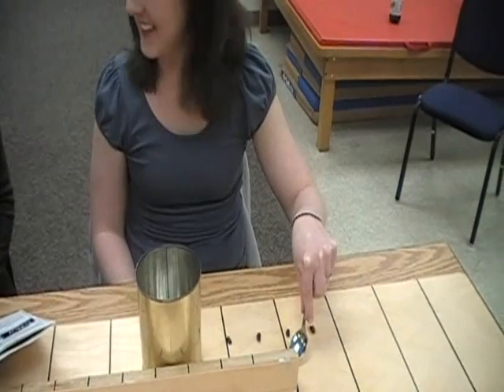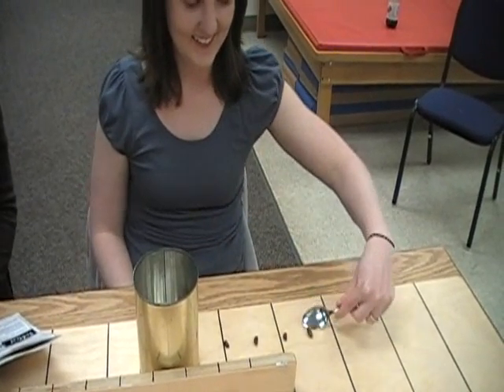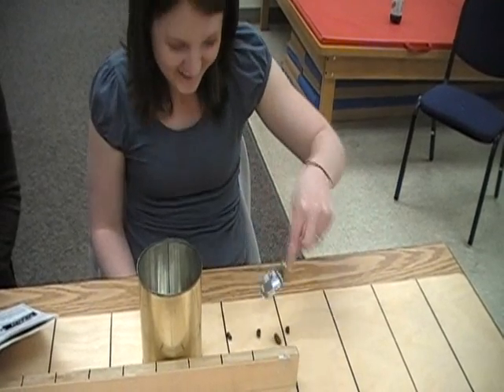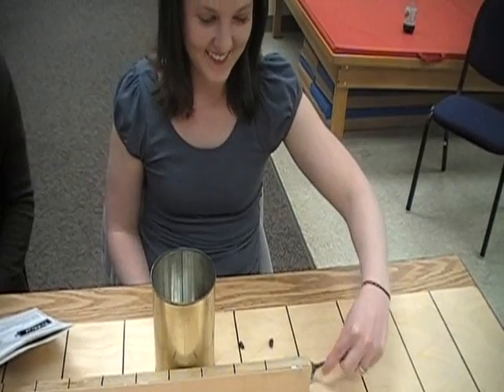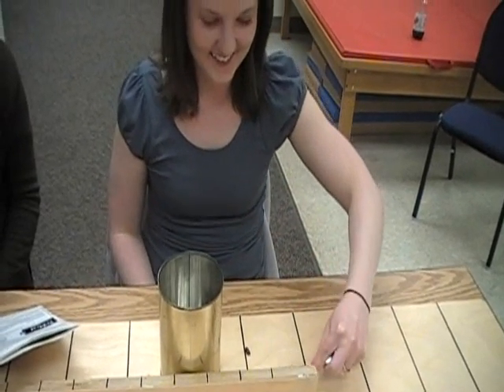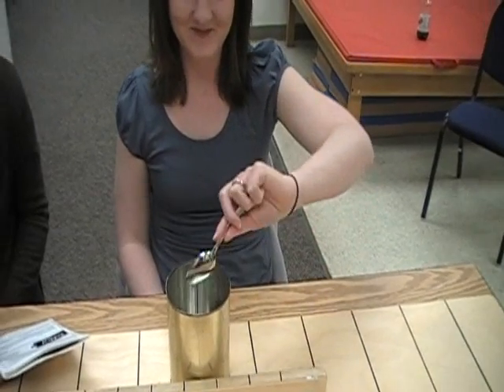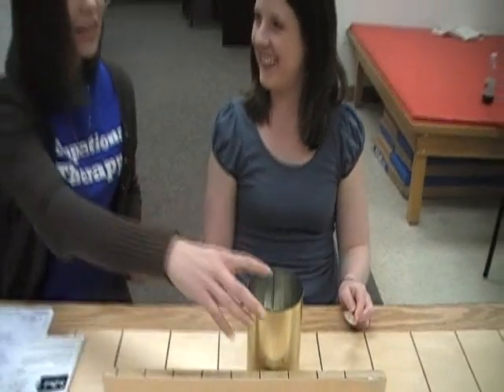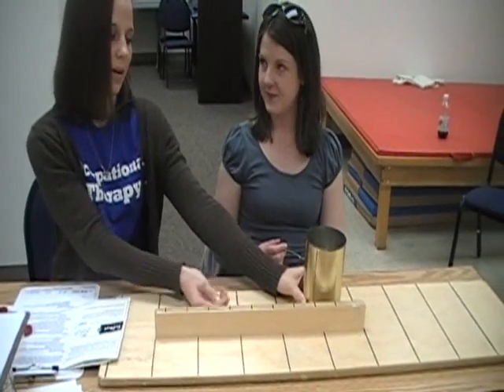Can you push it up against something? Then you would repeat the same task with the dominant hand, except you would set it up in the opposite manner.